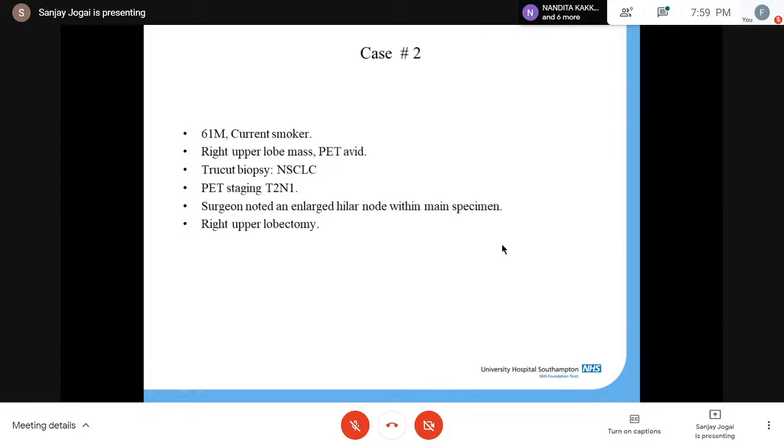Okay. So before you go on to the next case, I would just like to share my experience with you that CD56 is really the one that doesn't ever let you down generally. So I have also found. I've also been advocating it to all my juniors whenever they've done it.